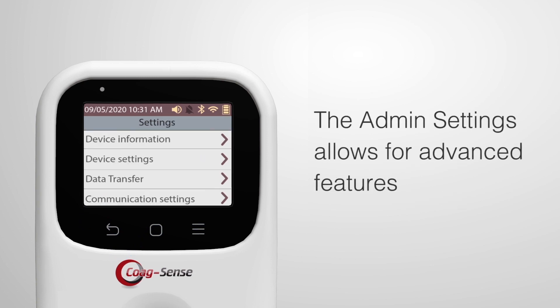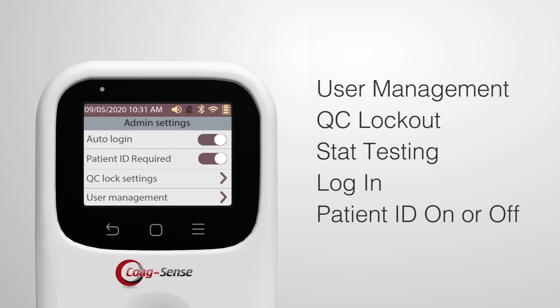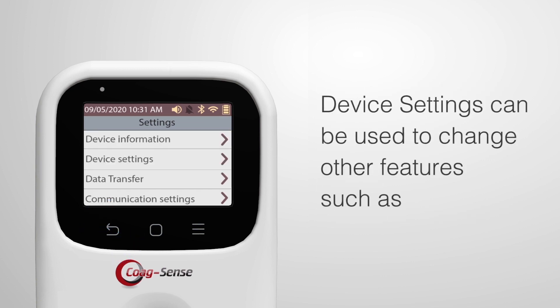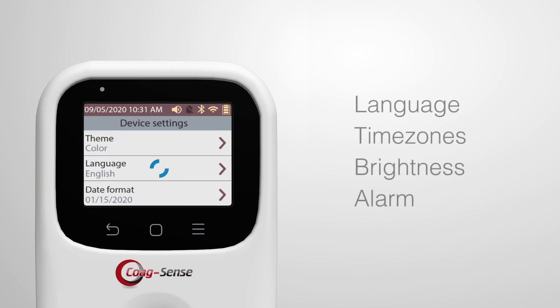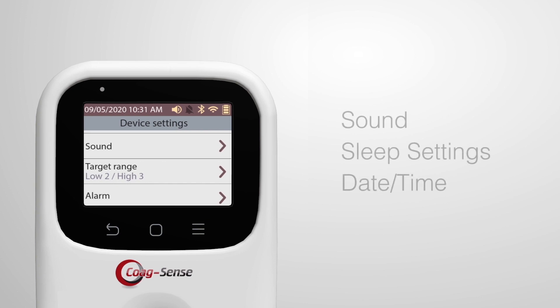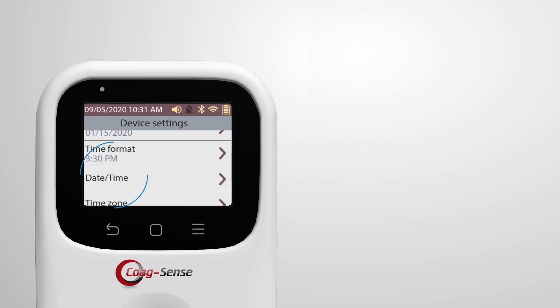The admin settings allow for advanced features such as user management, QC lockout, as well as enabling stat testing or login, and keeping the patient ID feature on or off. Device Settings can be used to change other features such as language, time zones, brightness, alarm, sound, and sleep settings.